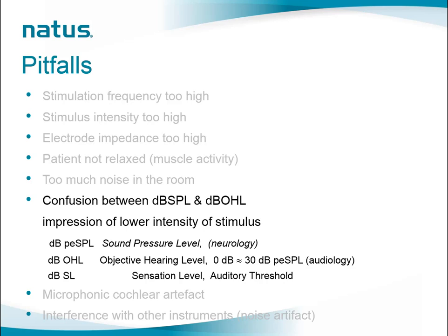Finally, there is a last term that may be used that you might hear of, which is decibel SL, sensation level or auditory threshold. So that is also a term you may see on your systems, but that's purely the assessment of the auditory threshold of a cooperative patient.